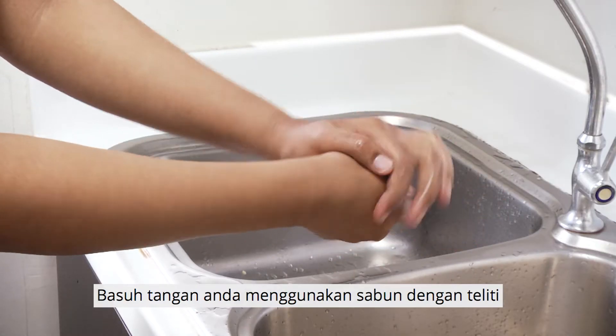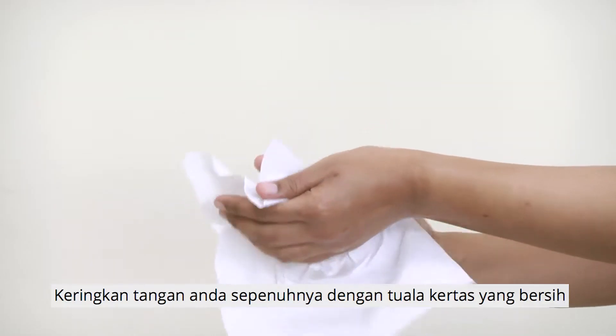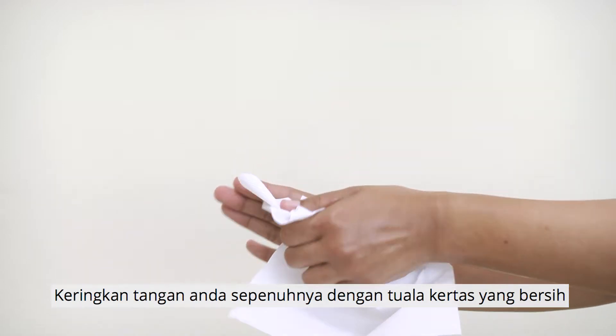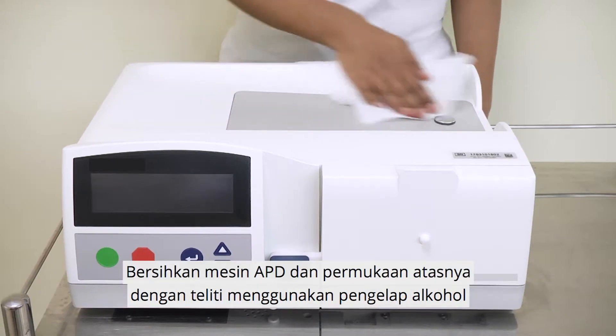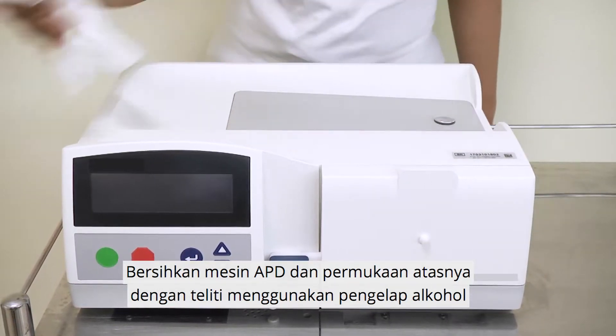Wash your hands thoroughly with soap. Dry your hands completely with a clean paper towel. Clean the APD machine and surface top with an alcohol wipe thoroughly.